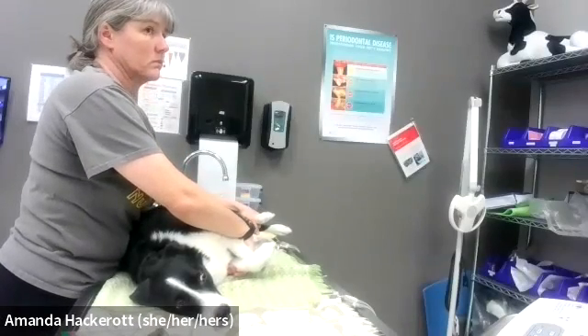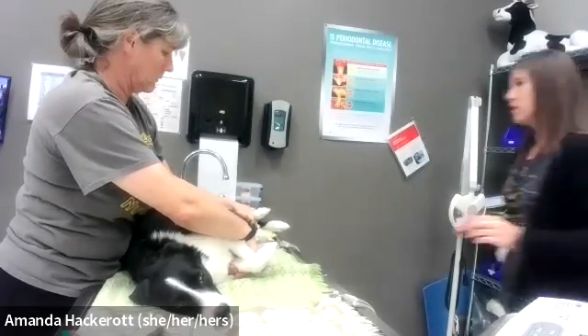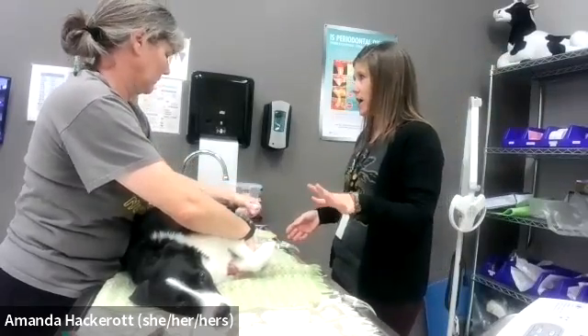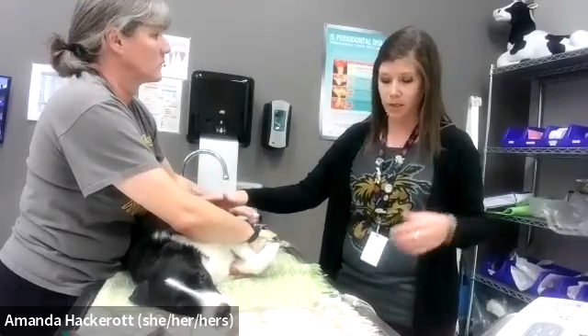This video is going to be a demonstration on how to place EKG leads and how to run your EKG. The first thing you have is a patient who is in right lateral recumbency. This makes it easier for us to access the left side of the body, which is of course where the heart is going to be.